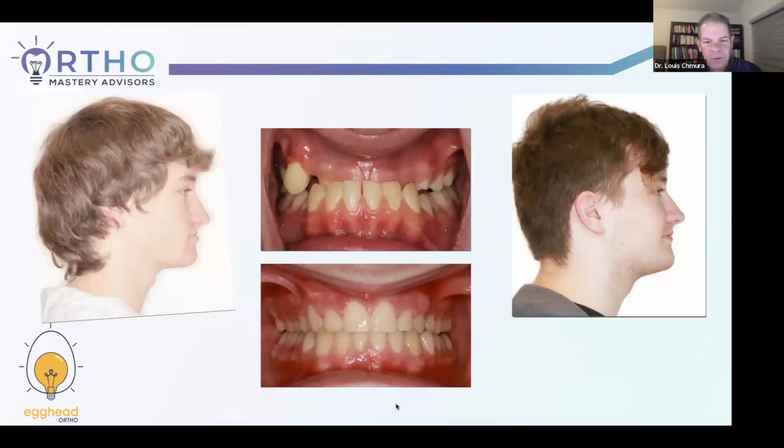You see how the gingiva look the same? You see how the teeth look the same? The exposures are the same? Yes, the orientation could have been a little bit better on the lower one, but you can actually see all the posterior teeth. You see more of them on the right than the left. I would be happy with these if we got these. It's when we get stuff that doesn't look like that that makes me crazy.